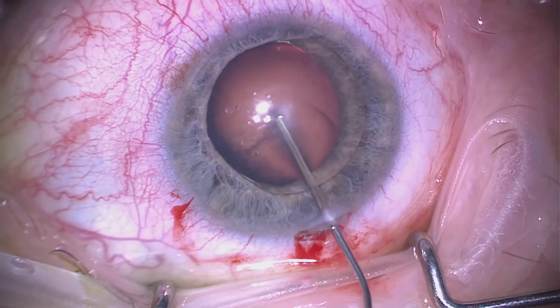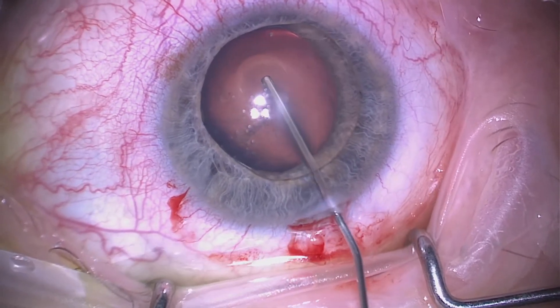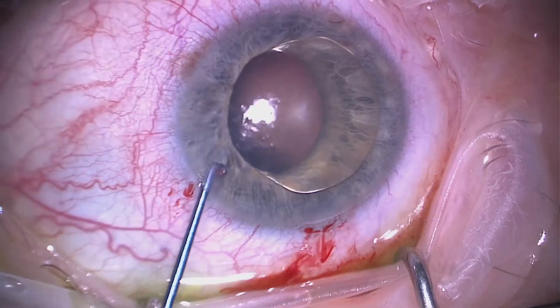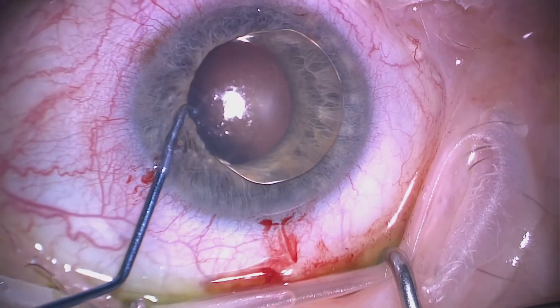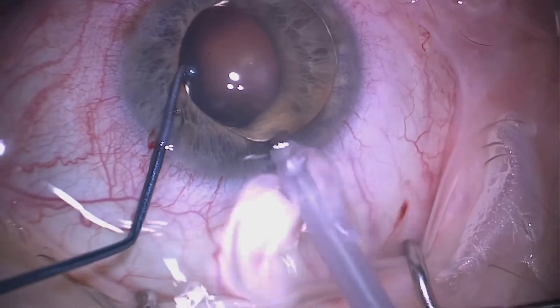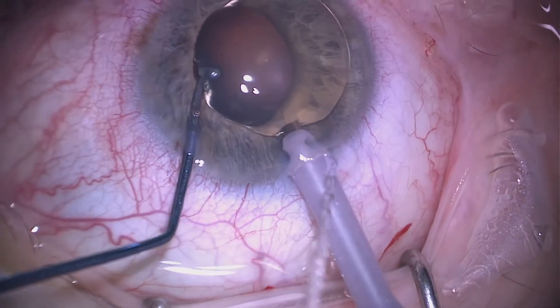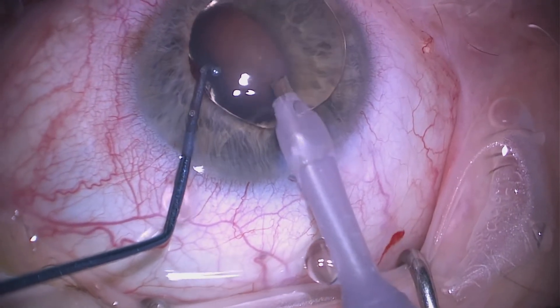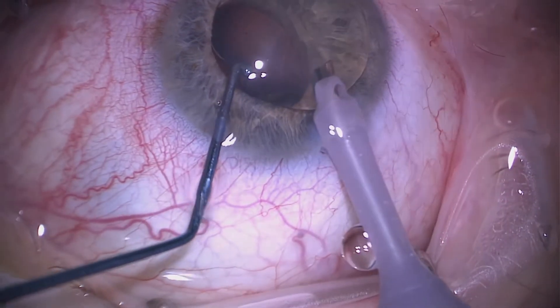A little bit more viscoelastic between the lens and the cornea just to protect the endothelium, and then we use a mushroom to place this behind the lens. We then go ahead straight with the phaco probe and impale it into the capsule of this lens.